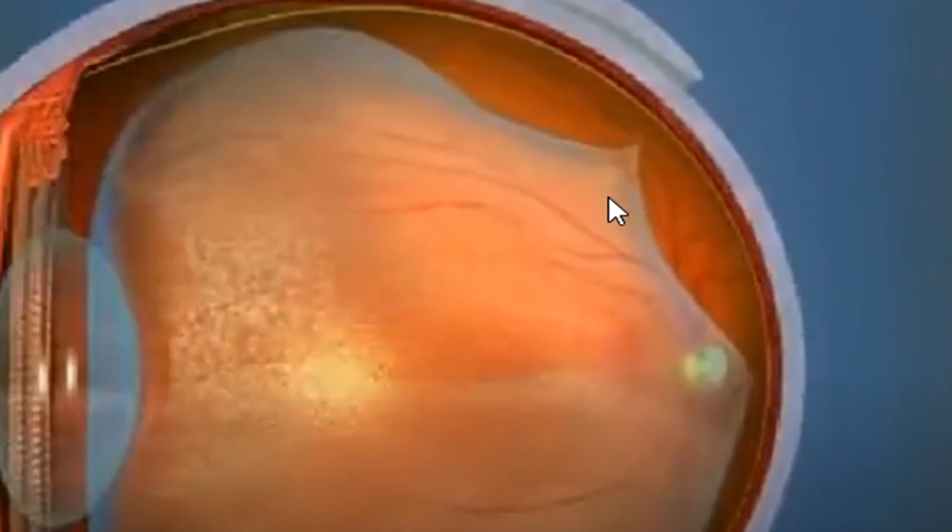That's right. But during this detachment, maybe you have a small area that's strongly attached. Actually, it's probably due to epiretinal membrane formation, due to tractional force. It may be due to that end with traction RD. Many reasons. Okay, but you have this sticky traction. So what will happen? Let's see.